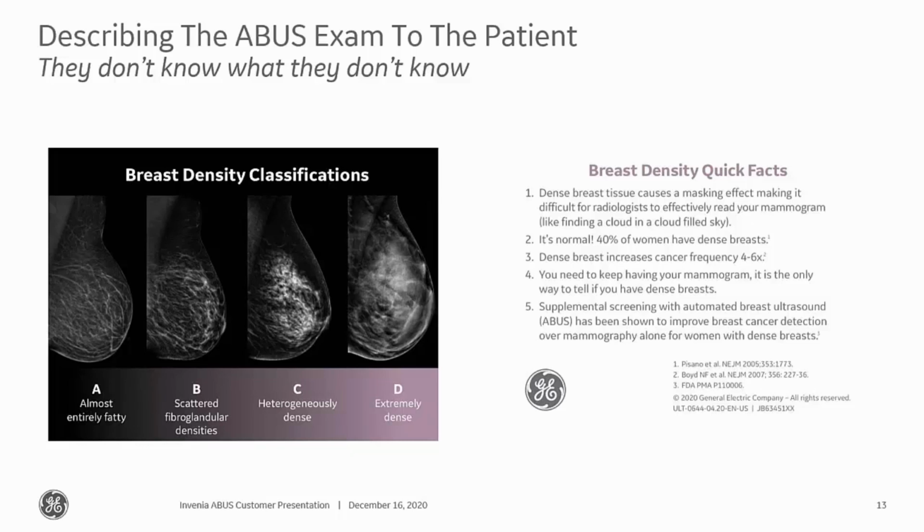So look for that. And all of you should be, hopefully, on the ABUS Club, you can reference these cards in the marketing corner tab of the ABUS Club. So if you don't have information or you don't have a login for the ABUS Club, please reach out to us. We want to make sure that you can get access to that. It has a ton of information that you can use, whether it's webinars, additional content, doctors' webinars, articles, like I said, marketing information. There's all kinds of information on that.